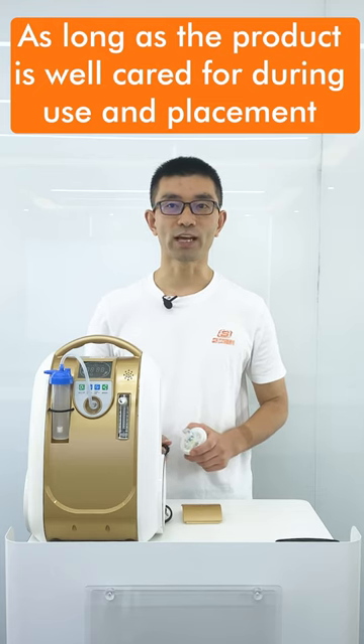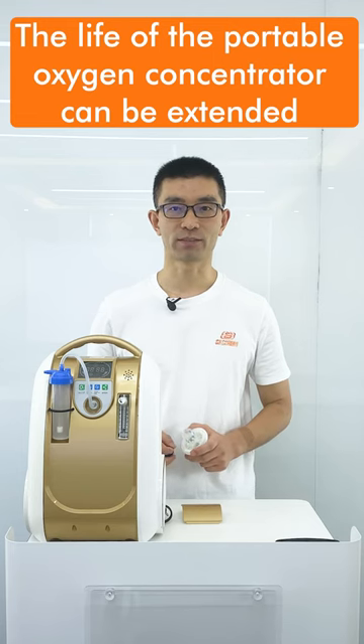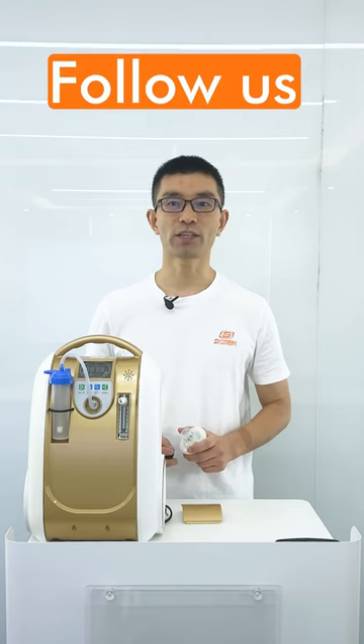As long as the product is well cared for during use and replacement, the life of the portable oxygen concentrator can be extended. If you need to learn more about the maintenance of portable oxygen concentrators, follow Olive Company.